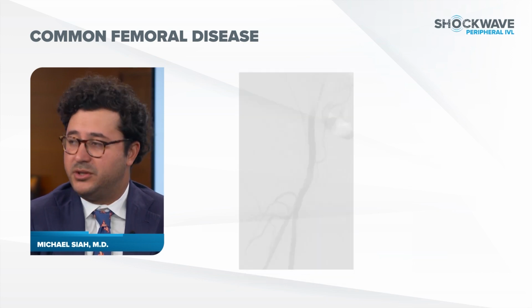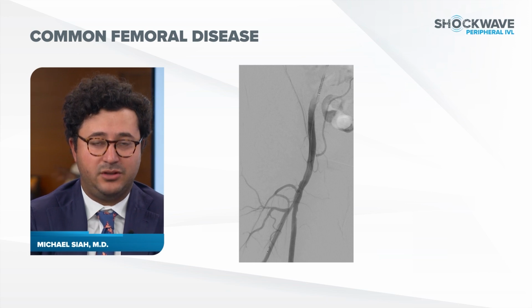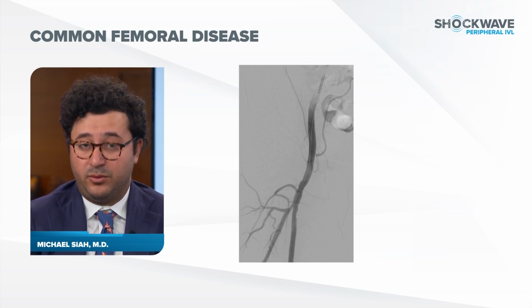And when we took our completion angiogram, there were audible gasps. It was pretty remarkable to see this type of result from a procedure that took less than 40 minutes to do.